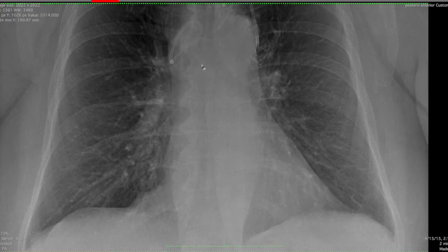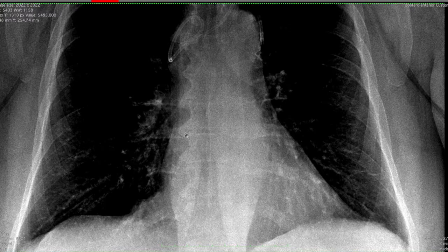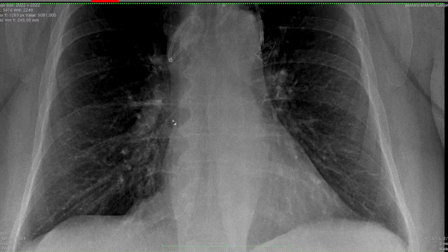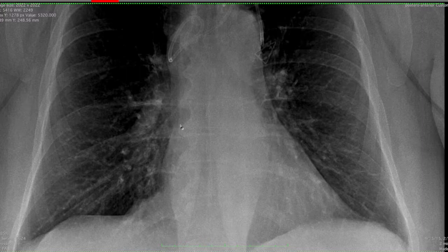Other people will find the carina and try to measure vertebral bodies. So here are two vertebral bodies, and here's the carina — around here should be where the cavoatrial junction is, maybe a little low. But that'll give you a ballpark. Bottom line, as long as you use one of those and use it consistently, and have an internal reference for cases where it doesn't make sense, you'll probably be okay.